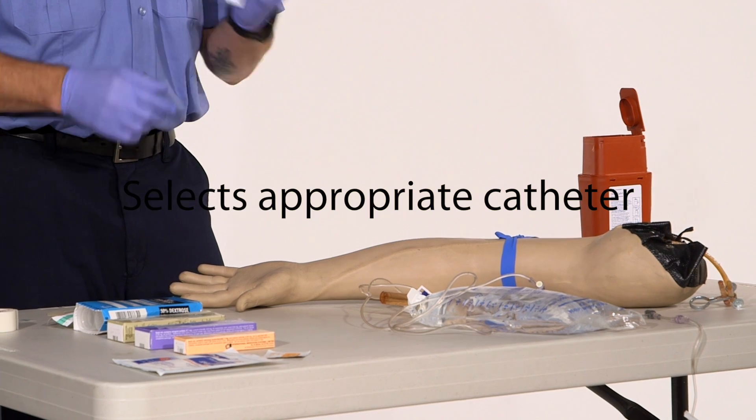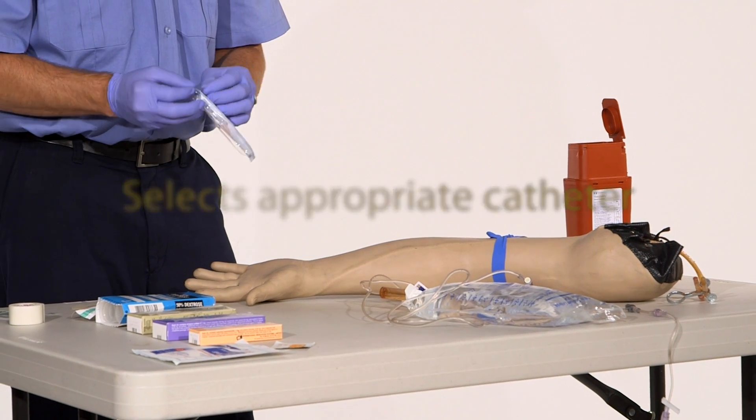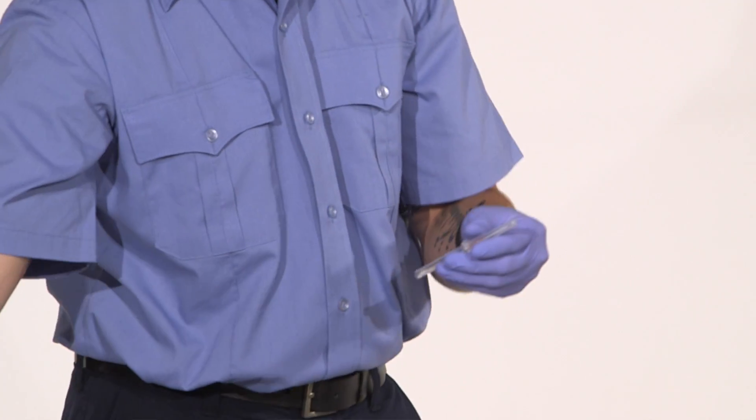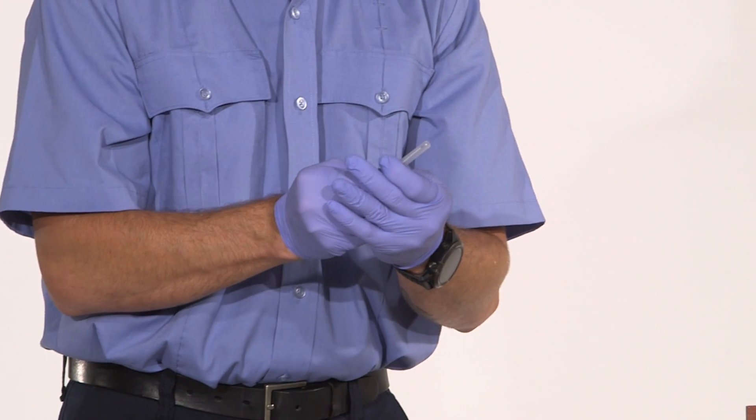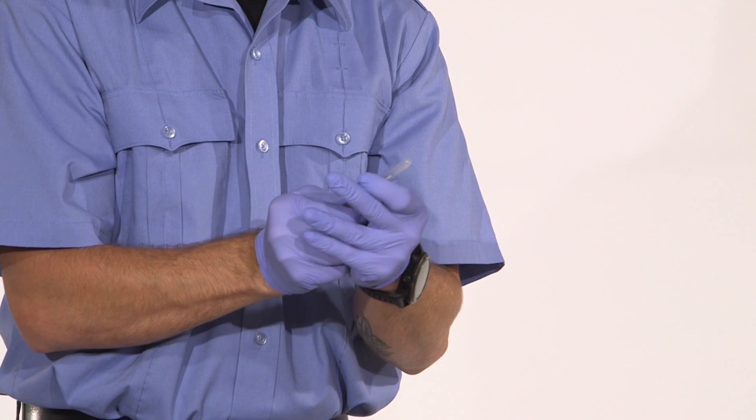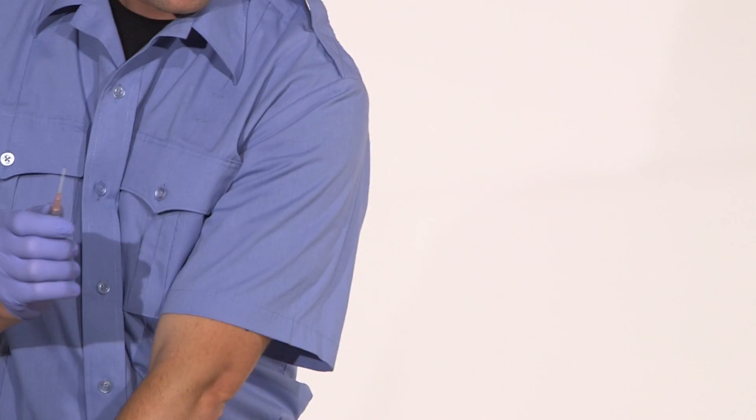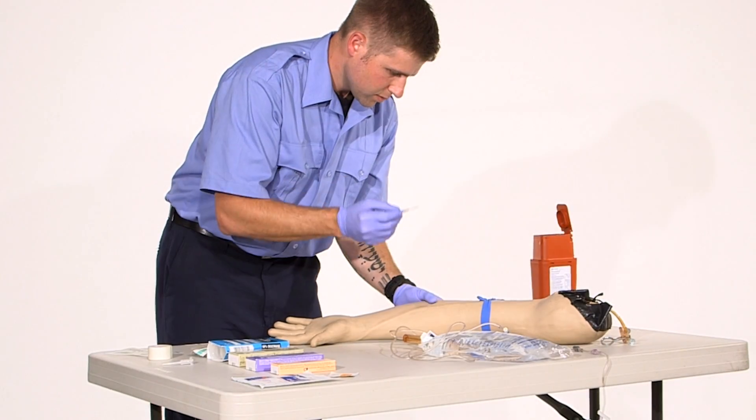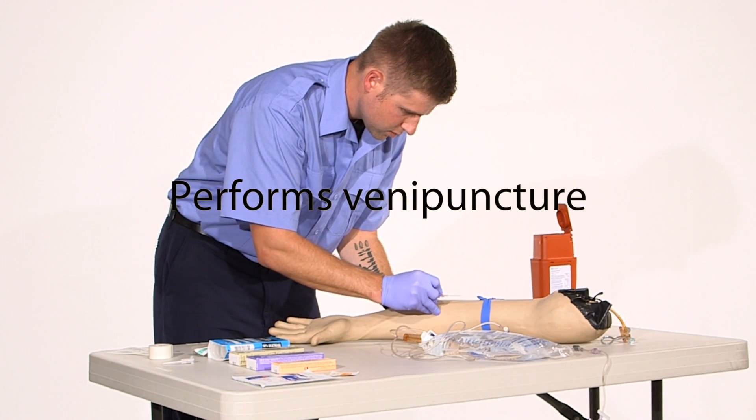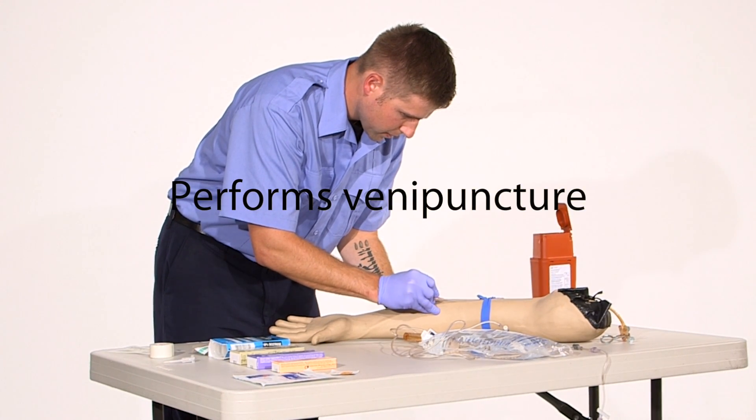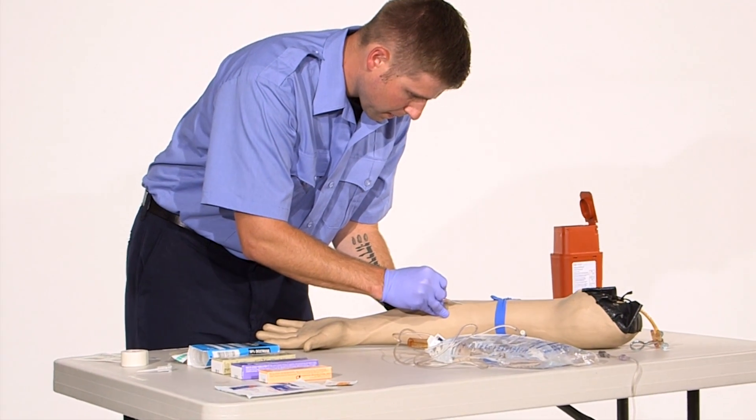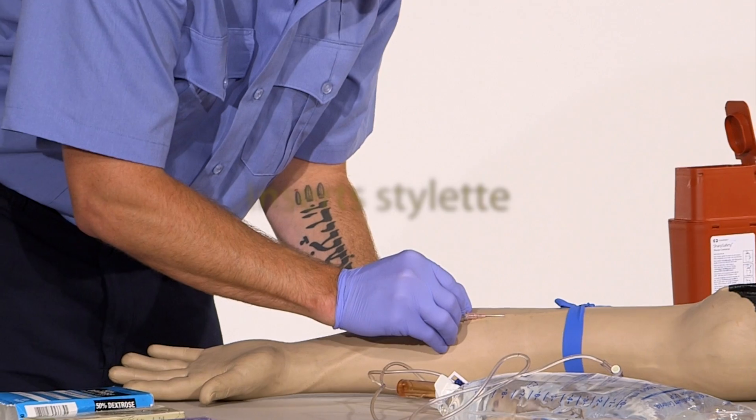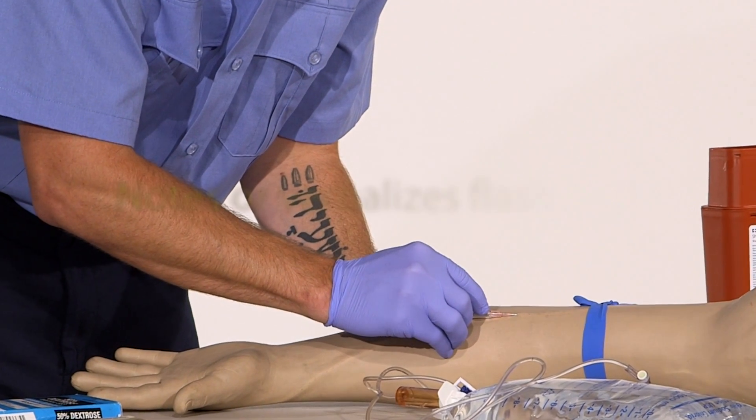I'm going to pick the correct size catheter that I have here. Take the cap off, make sure it's loose. I'm going to place traction on my vein. Bevel up and place the catheter.